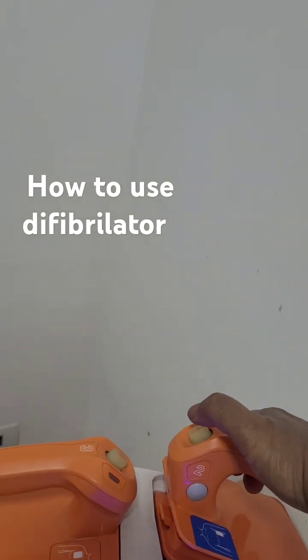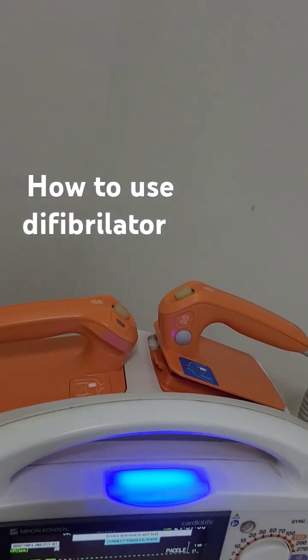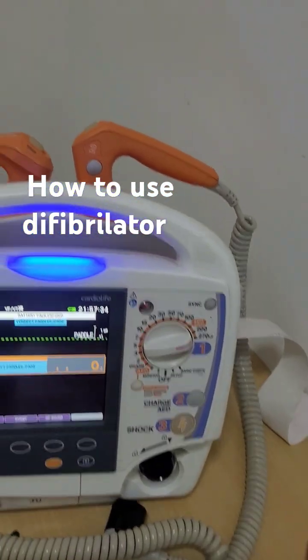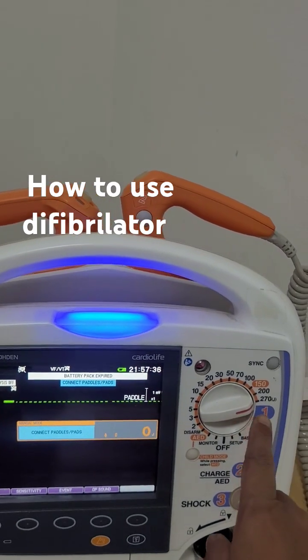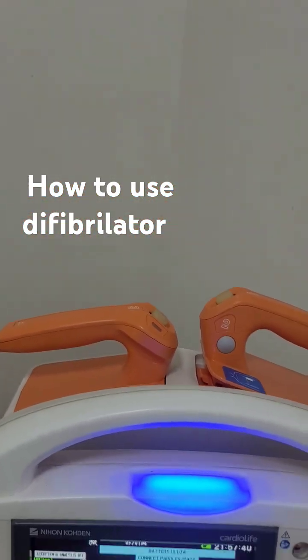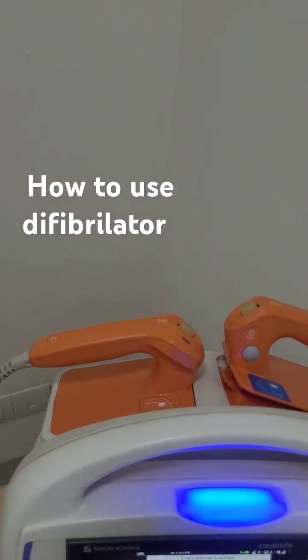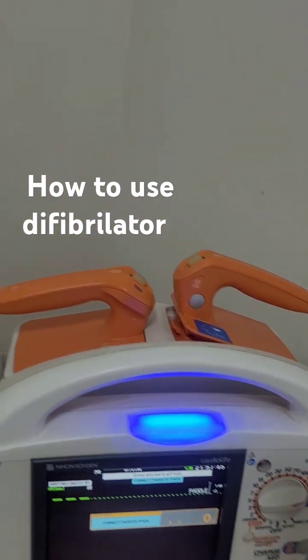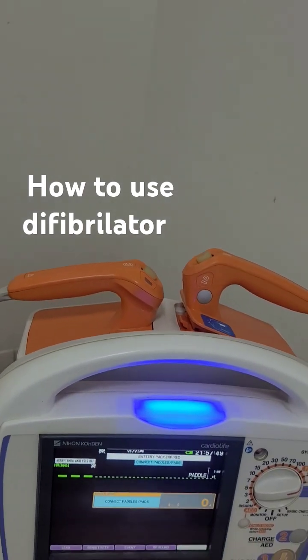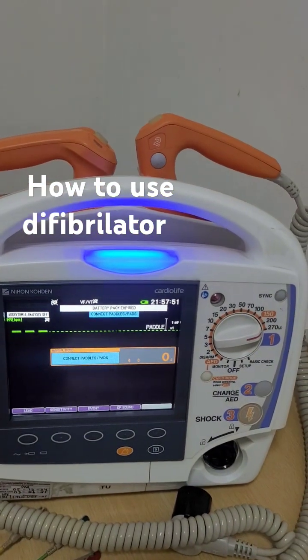Once charged, you say 'all clear' and then with both hands you press to deliver the energy. So it's simple: turn on, select energy, charge it, clear the patient, and give the shock by pressing this button.